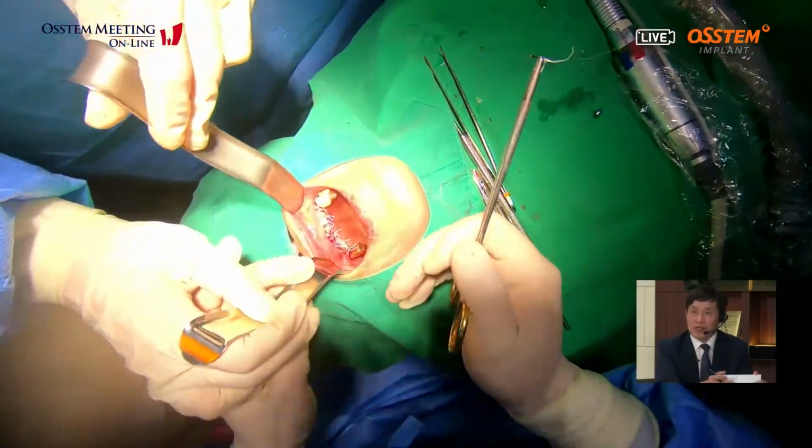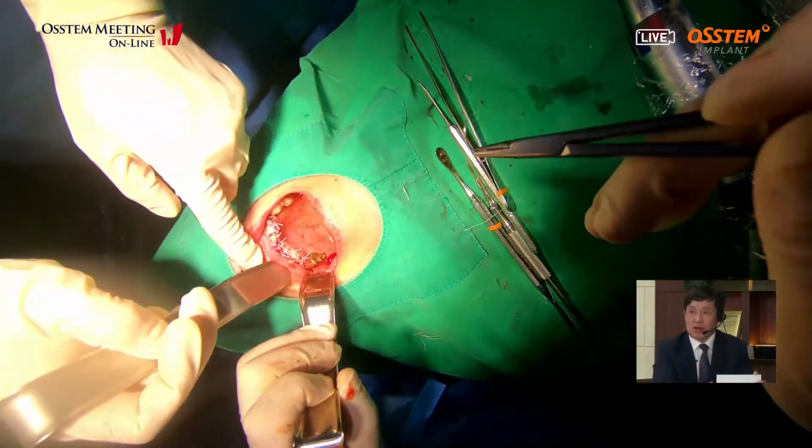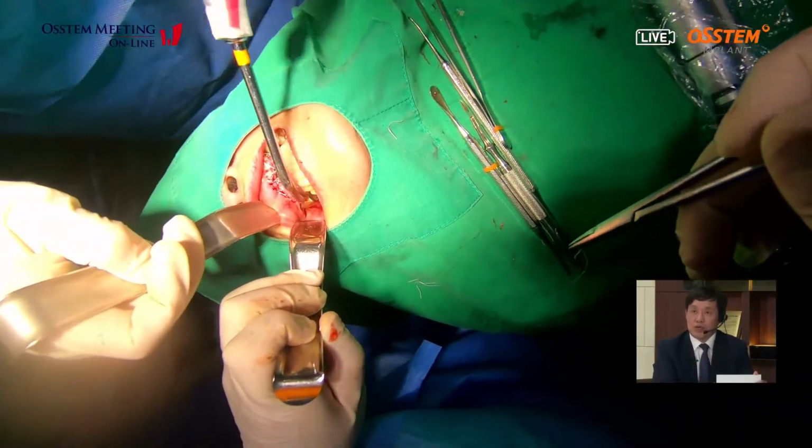And he did the immediate placement after extraction, but he already did the periosteal releasing sufficiently, so you can see the flap is a very good approximation without tension.